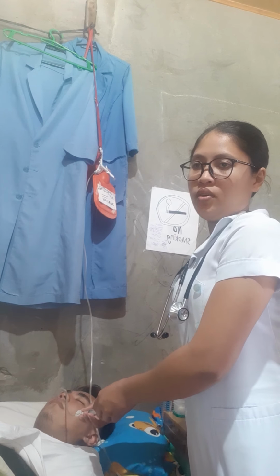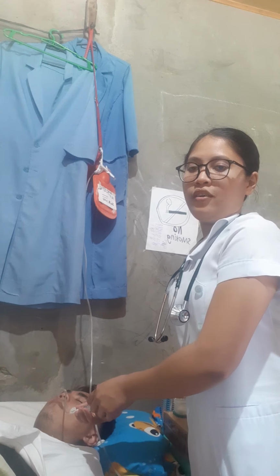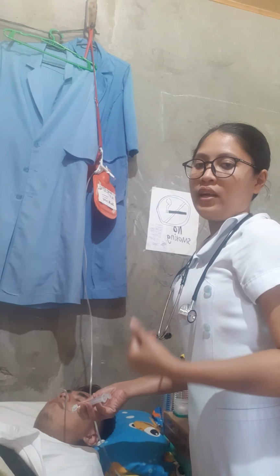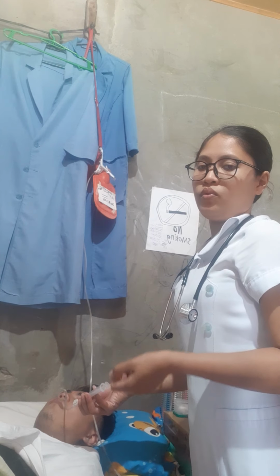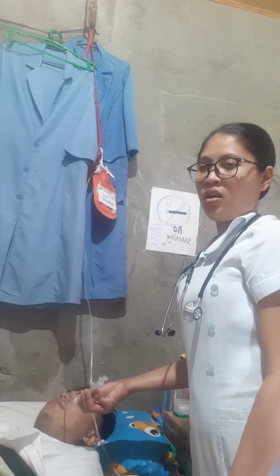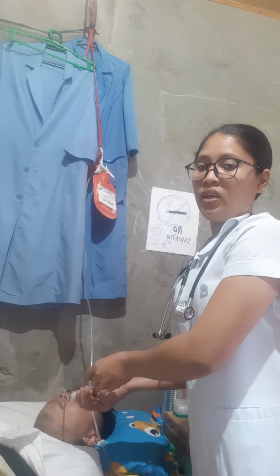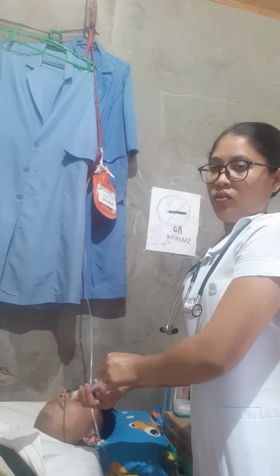We need to flush the feeding tube before all of the formula runs through the tubing, because flushing will clear the feeding or the medication if it was the previous one in it.